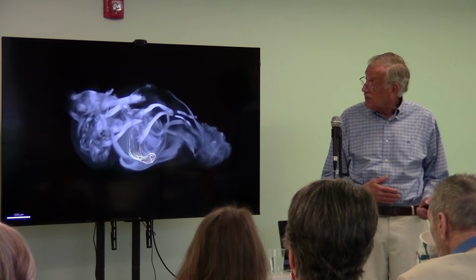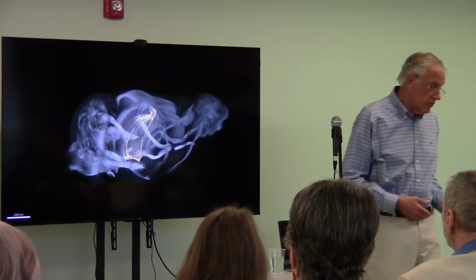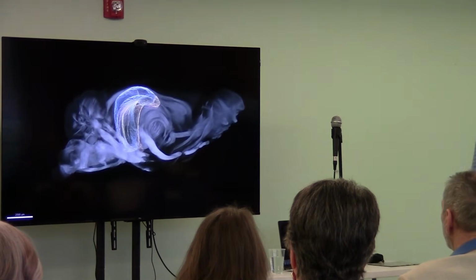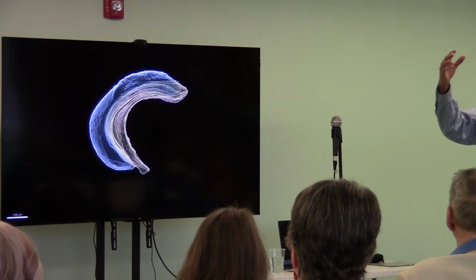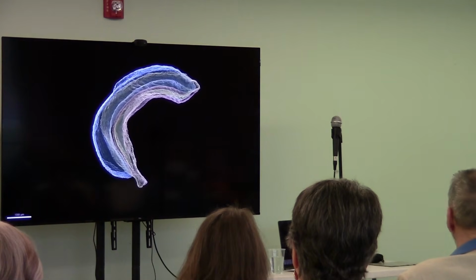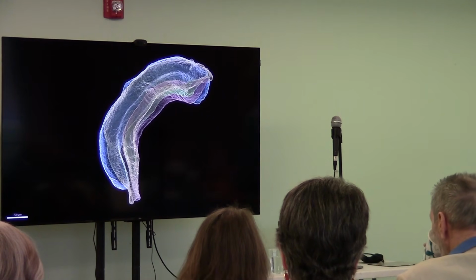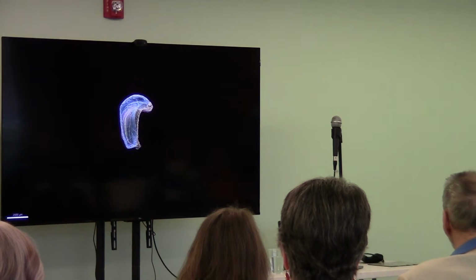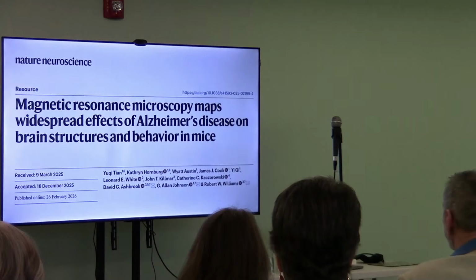So when I do that, then I can go into the computer and say, let's look at the hippocampus, for example, break it down. These are 4 of the most critical parts of the hippocampus. Tell me exactly how big they are. Tell me how long they are. Give me a shape analysis. Give me all the details that you can for the BXD29, for the BXD29 with the Alzheimer's disease, for BXD43, etc. And you just leave the computer working away.